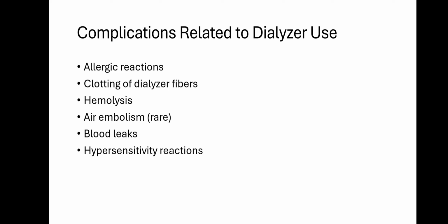The last topic is complications related to dialyzer reuse. Allergic reactions may occur if the dialyzer is not properly washed. Then clotting of the dialyzer fibers, hemolysis, air embolism, blood leak and clotting, and hypersensitivity reactions. These are the main complications that occur with the dialyzer.